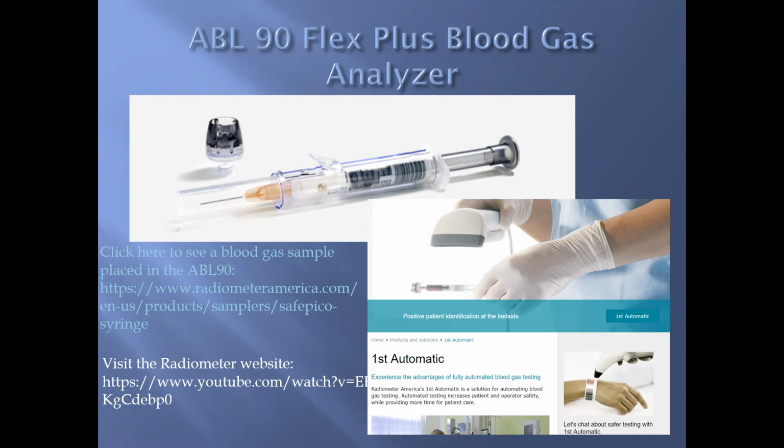Oh yeah, that's right. So you scan the syringe with the scanner, and then you scan the patient's wrist or vice versa. So that attaches the blood gas that you just drew to the patient.